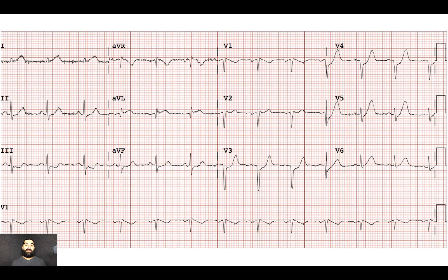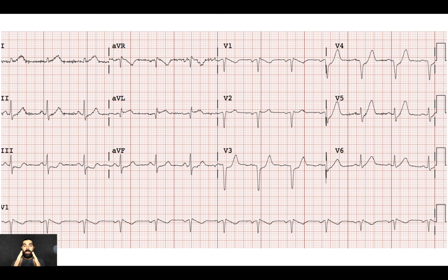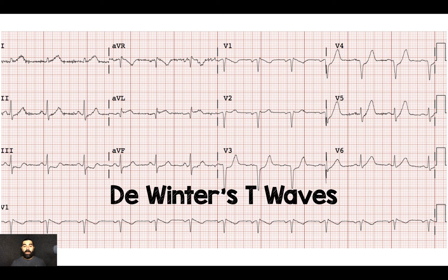There's a fourth T wave we haven't talked about — the DeWinter's T wave. If you look at leads V3 through V6, you can see this ST depression that kind of goes up into a large T wave that is symmetric on both sides, both going up and coming down. A DeWinter's T wave is when you see that ST depression with that symmetric hyperacute T wave.